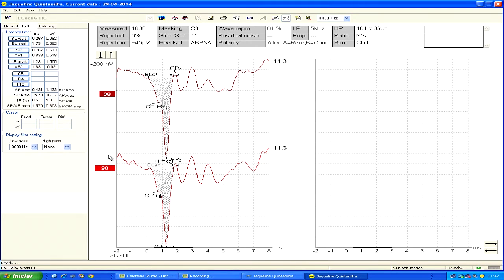Another criterion you may use for hydrops is the AP latency difference observed between condensation and rarefaction clicks. We will do this analysis here.